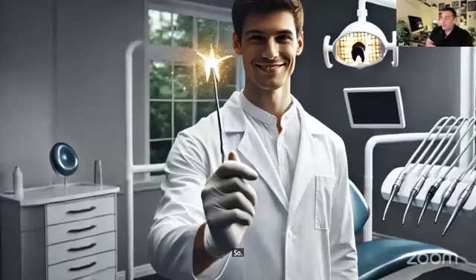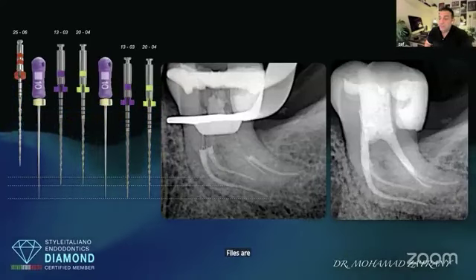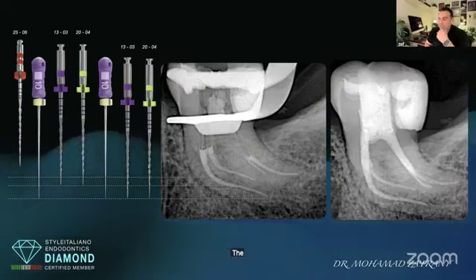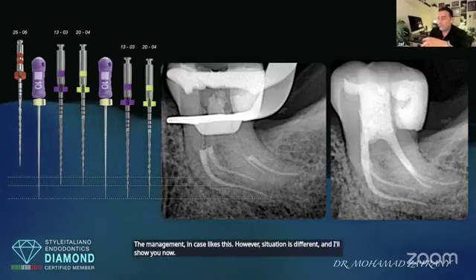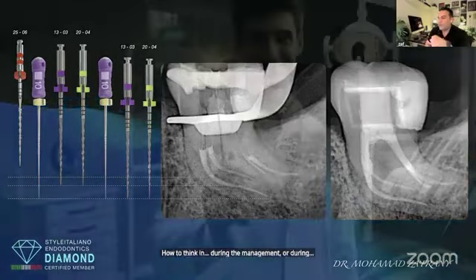Many dentists would think that in managing difficult cases like this, files are the magic wand, or that files alone can solve the difficult part of the management in a case like this. However, the situation is different, and I'll show you now how to think during management or during shaping of cases like this.